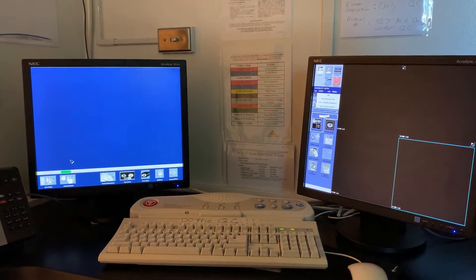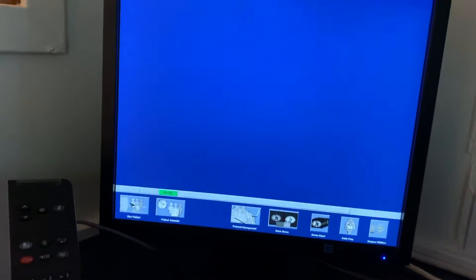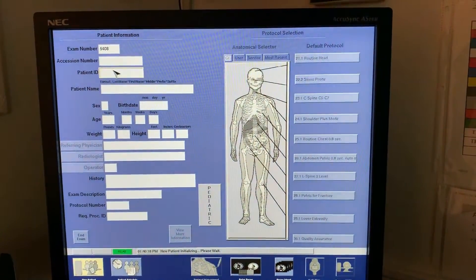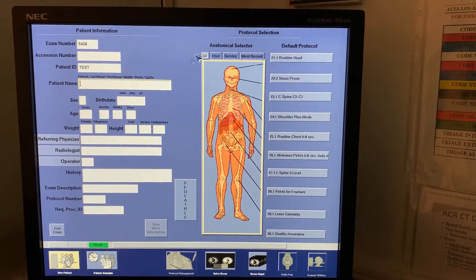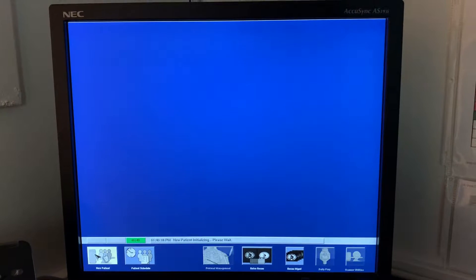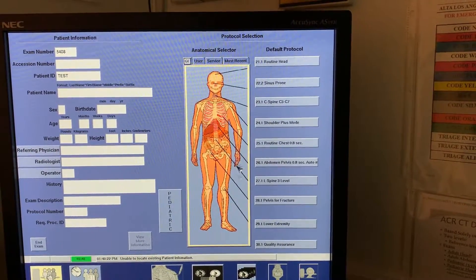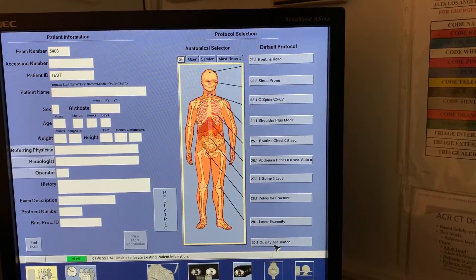How to perform a QA test scan for a GE Light Speed 16 slice. First, click on New Patient and enter a patient ID of 'test.' Click Enter. You should see Quality Assurance down at the bottom.